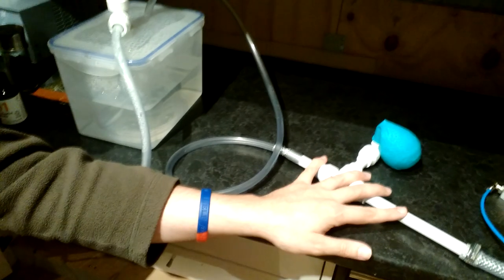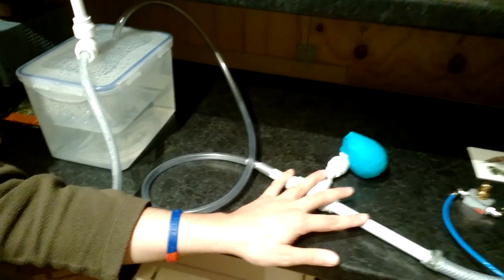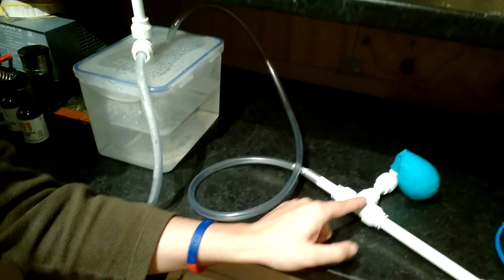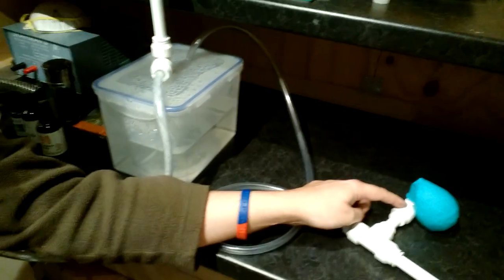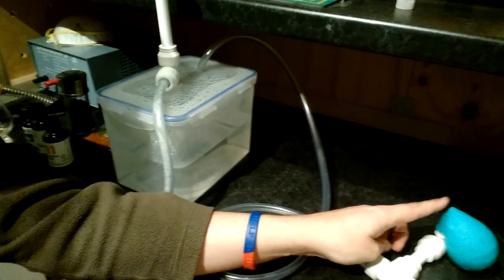So here we've just got some 15 mil push fit pipe with an equal T and a stem elbow on which is mounted a balloon. I'll tell you the reason for that later.